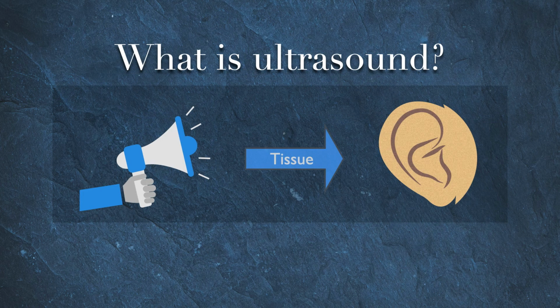Ultimately, ultrasound is the transmission of sound waves through tissue for which your ultrasound machine generates an image. Interestingly, the ultrasound probe itself not only sends out the signal, but also listens for the echoes to return. This phenomenon, thanks to some brilliant physicists, is what allows you to see your patient's anatomy.